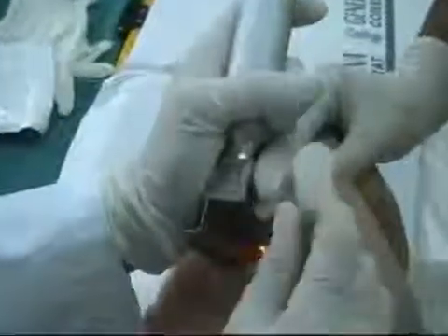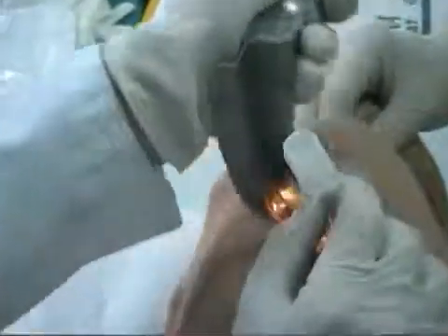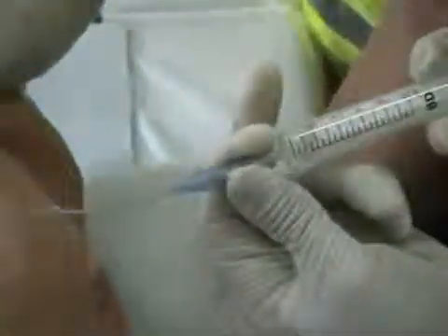Then pass the endotracheal tube through the vocal cords until it disappears into the trachea, and advance the tube until the balloon is 3 to 4 centimeters beyond the vocal cords. Remove the stylet. Remove the laryngoscope and inflate the balloon of the orotracheal tube with air to prevent air leaking during the ventilation with the bag valve mask.